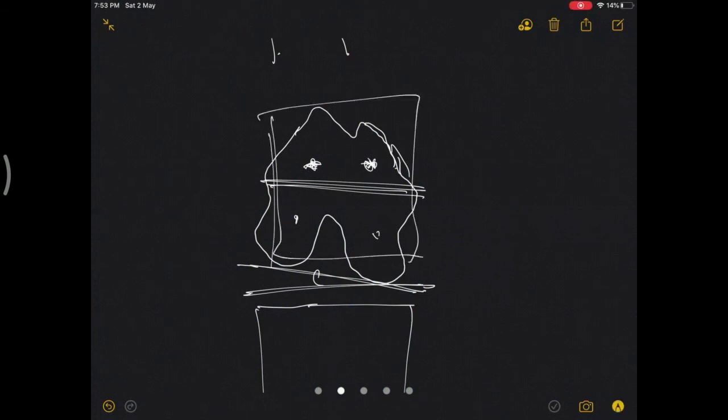Okay, so what I was telling is, if you don't consider this rotation, if you cut the way the posterior condyles are, then you will be cutting equally, and you have an increased lateral gap as compared to the medial gap.